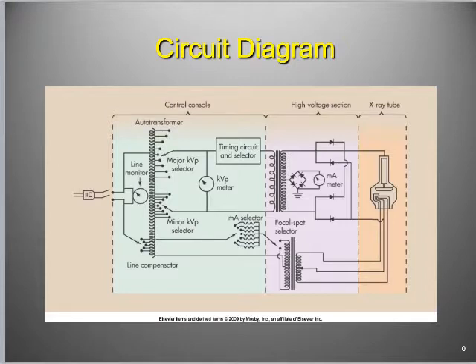Well, I don't know what it would do. It might open up the portal to the other dimension and cause the brownout. That's another guess. Or it might be the place where all the raccoons come from that are falling into the transformers. Another guess. It becomes very theoretical at that point. But we do not want to be passing alternating current through the X-ray tube, right? We want direct current, right?